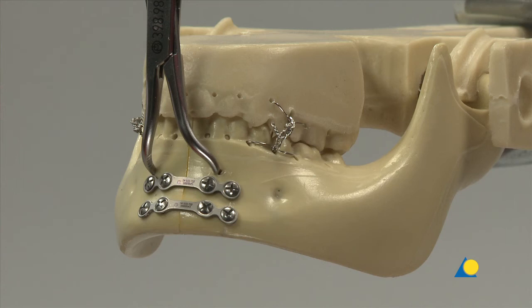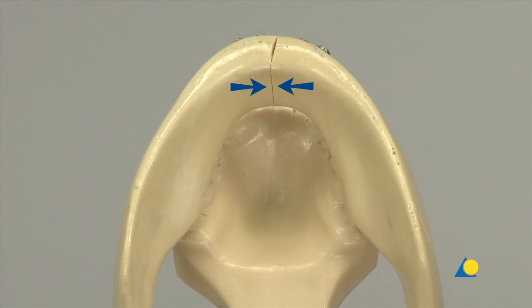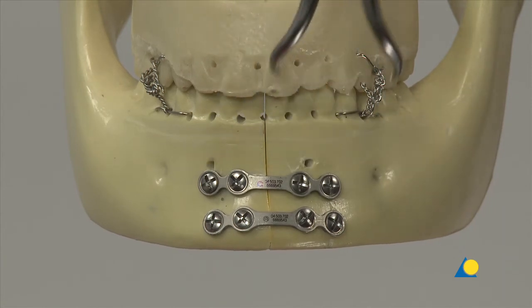It must be confirmed that the reduction is adequate, fixation is complete, and that no gap exists on the lingual aspect that would lead to occlusal disturbance and mandibular widening. The reduction forceps is removed.